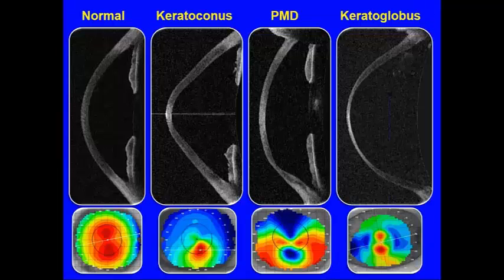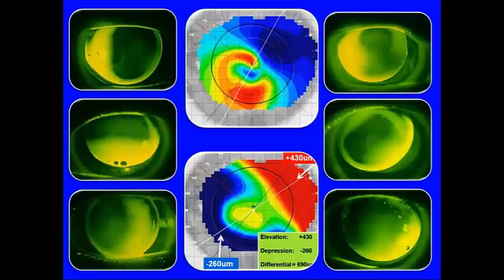As we know in clinical practice, there's a fair number of eyes that will fall into that category of having in excess of 350 microns. Many of them are keratoconic, ectasia corneas such as keratoglobus or bulging grafts, or patients with pellucid marginal degeneration. All of these become prime candidates for designs like the Ampleye. Now, what if you don't have a topographer?